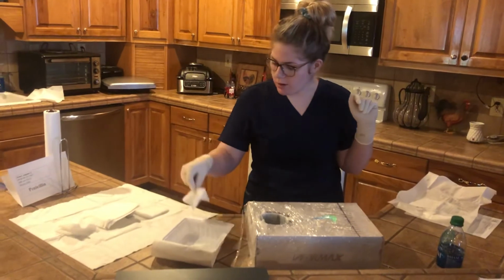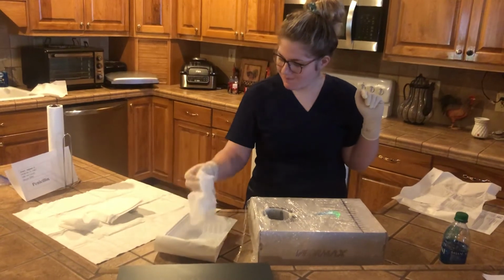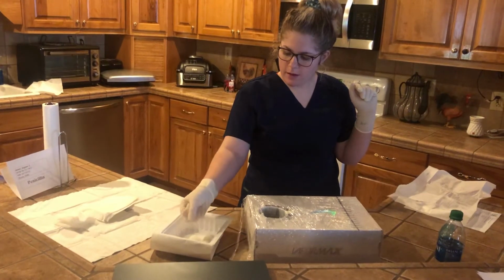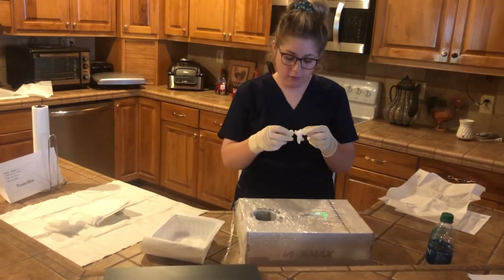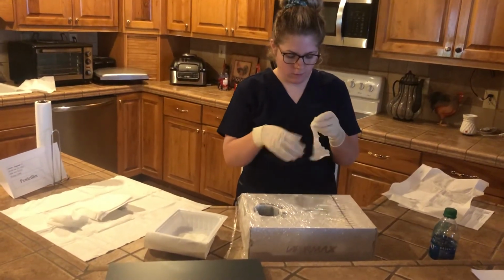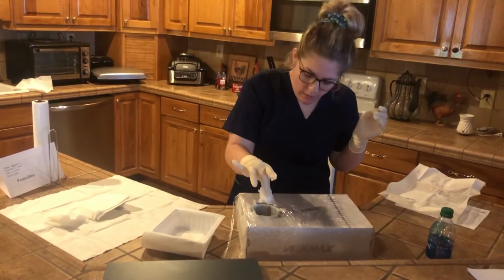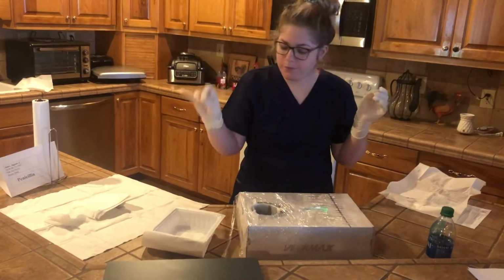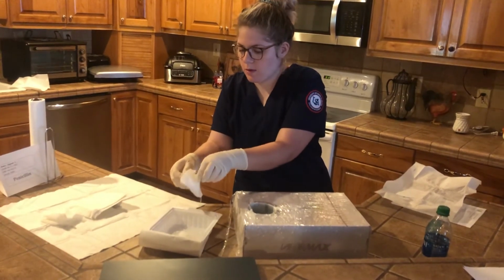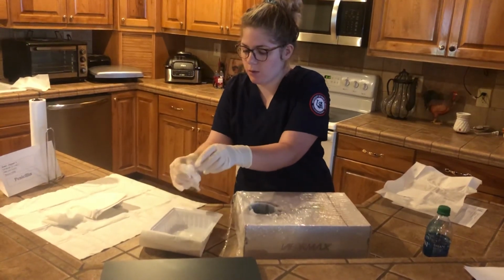I will get some more gauze and place in the saline. I will wring these out and fluff these, and place them in. I will be careful not to touch my gloves to the skin or wound. And repeat. You do this wet to dry method because when it dries, it will collect all the debris.